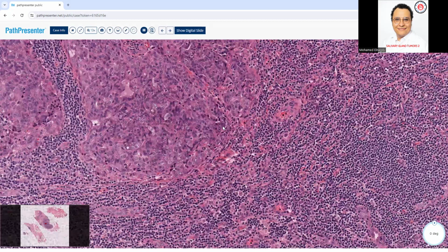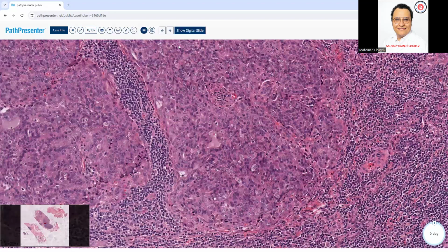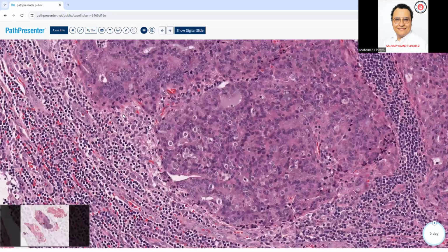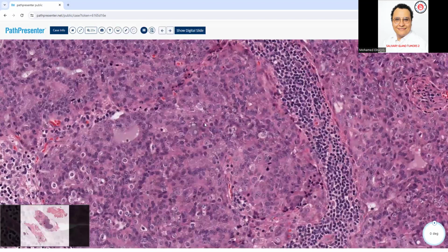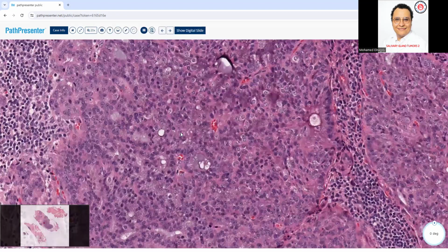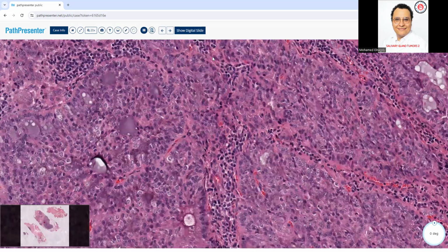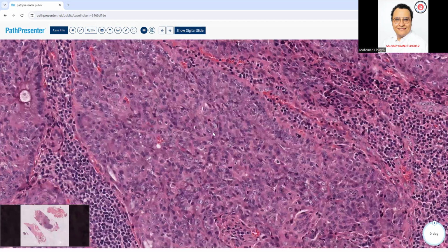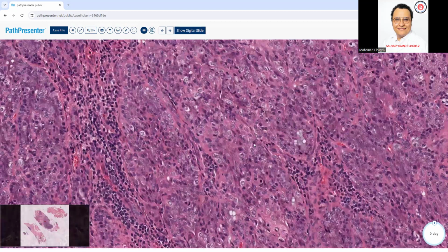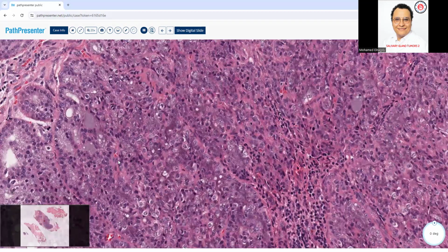Okay. Is that a lymphoid infiltrate? So that's lymphoid tissue or lymphocytes. Maybe inflammation. I don't know, but okay, let's look around in the cells and see. No, not anything with lymphoid tissue. It's a Warthin. We need to see the double layer. And I can't see any oncocytic cells here with a double layer. Yeah, I'm not convinced that this is Warthin.